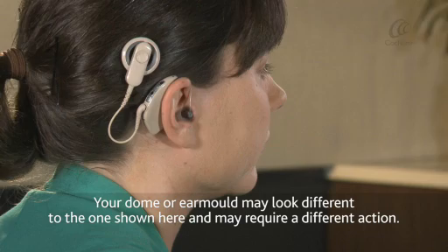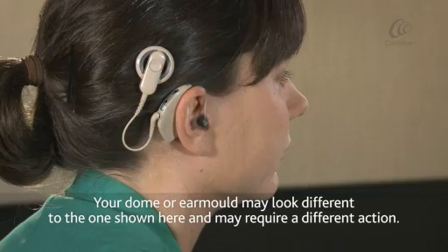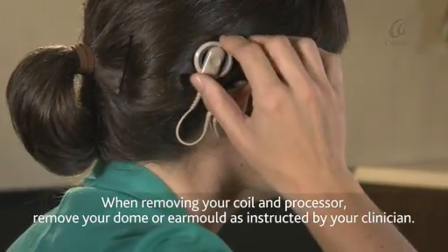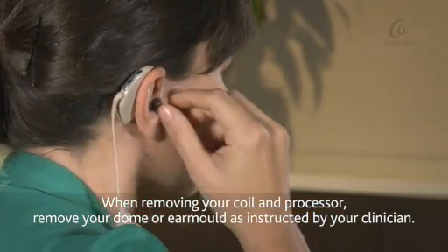Your dome or ear mould may look different to the one shown here and may require a different action. When removing your coil and processor, remove your dome or ear mould as instructed by your clinician.